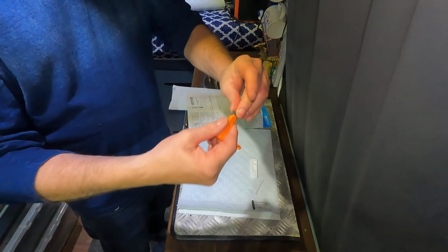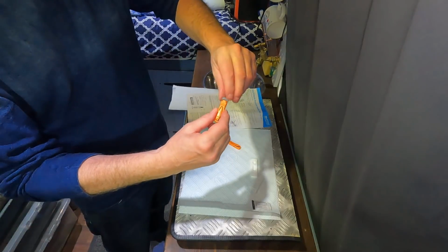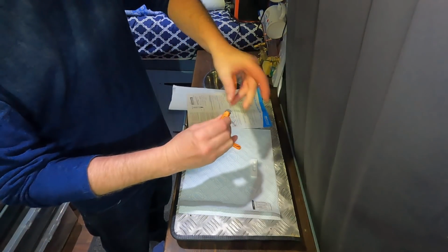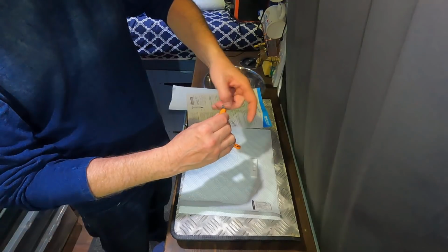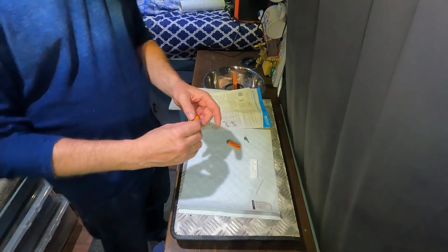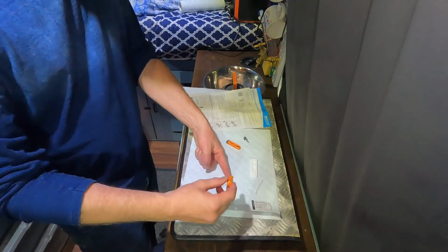Now this I need to turn. This is the pricker, this is the trigger. I need to turn it once. Again and again. Up, there you go. It says you'll feel it release. Once it pings out, there you go. I'm glad you can't see my face.